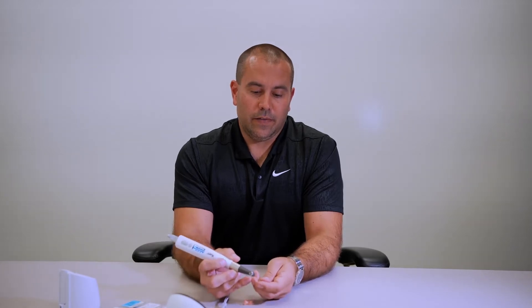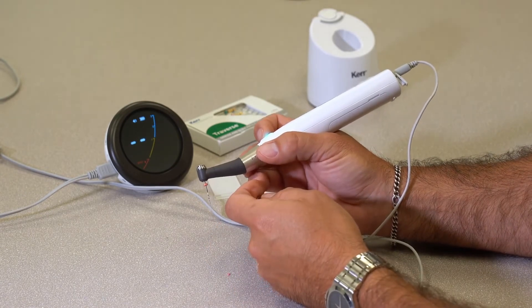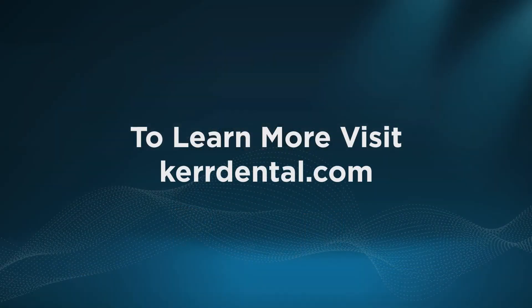Another nice safety feature is that when you do reach your working length, this file will automatically reverse so that you don't over-instrument, which is key. We always want you to take an estimated working length prior to shaping with any rotary instrument; however, this will prevent you from going long. And that's the Apex Connect and Elements Connect working together.